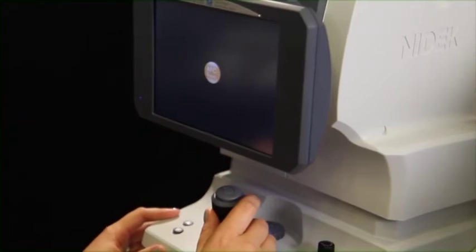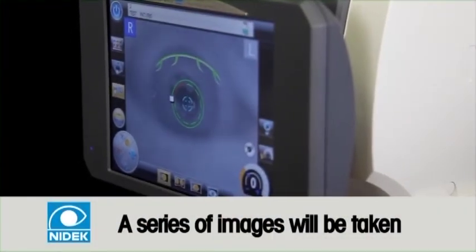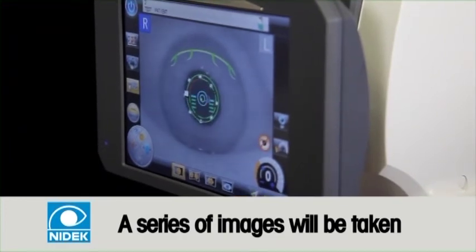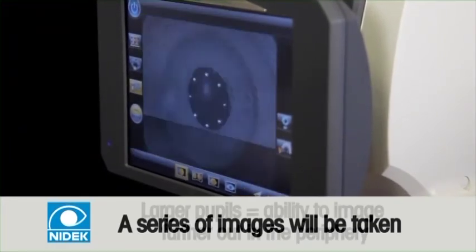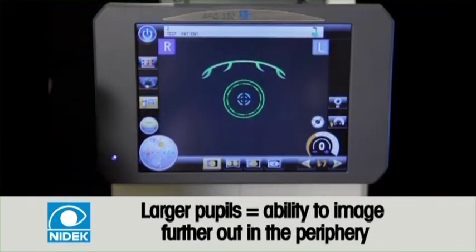The operator will need to search the retina for pathology to capture. Certain pathologies stand right out and others do not. Inform the patient that a series of images will be taken. It is not mandatory to dilate patients prior to peripheral imaging. However, the larger the pupil, the further one can capture out in the retina.